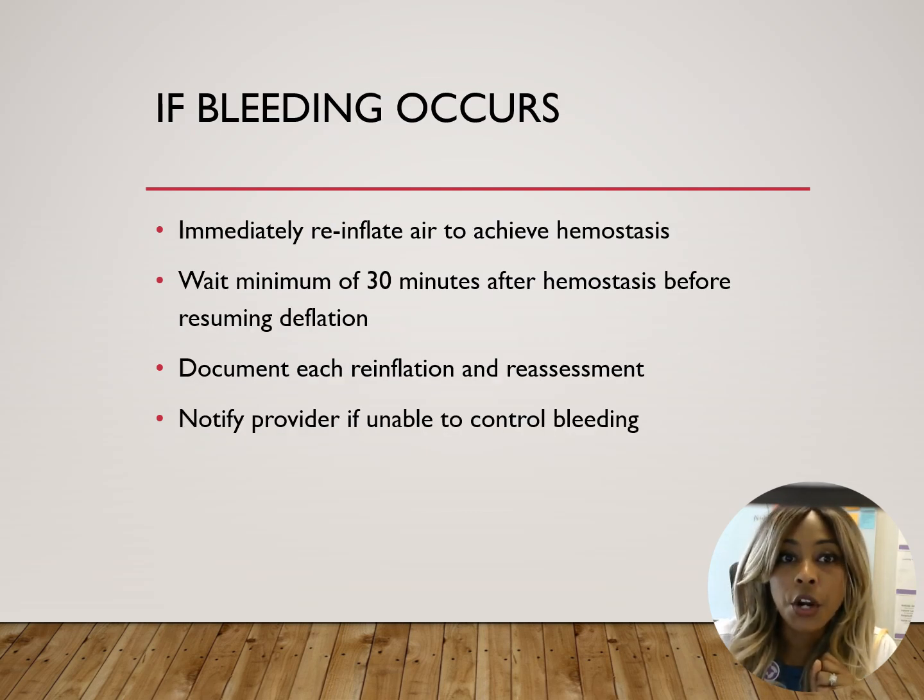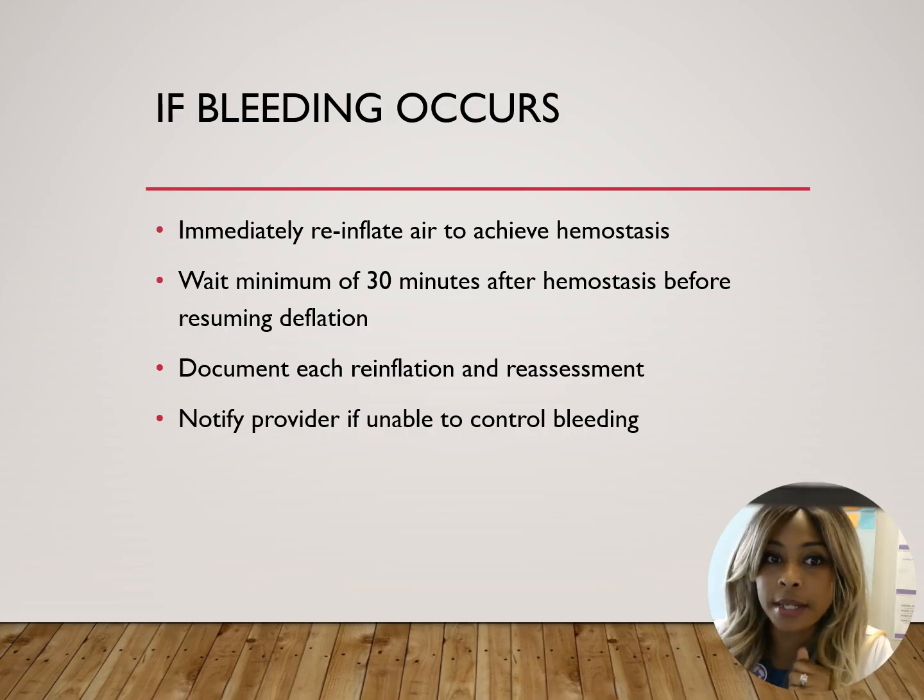If bleeding occurs, immediately reinflate air to achieve hemostasis. Wait a minimum of 30 minutes after hemostasis before resuming deflation. Document each reinflation and assessment. Notify the provider if unable to control the bleeding.